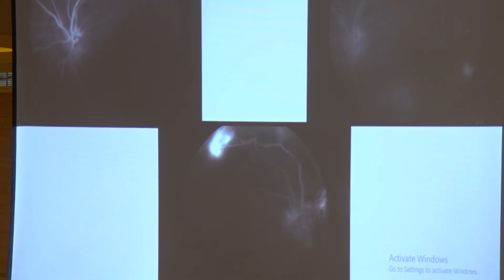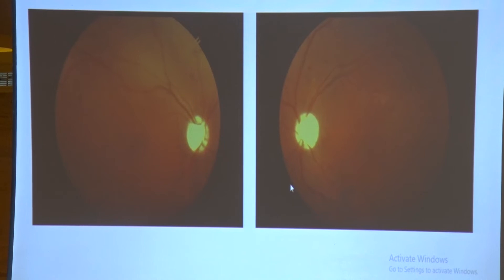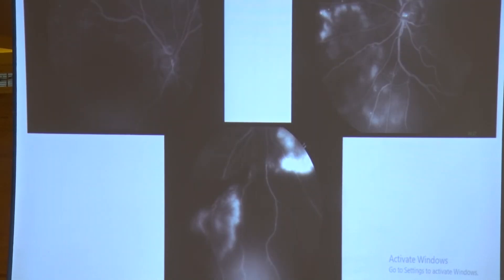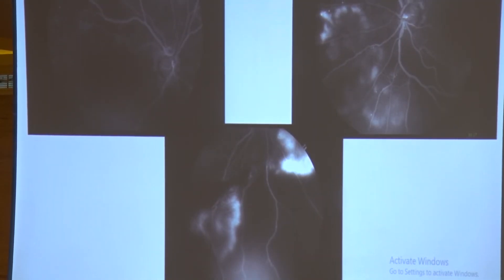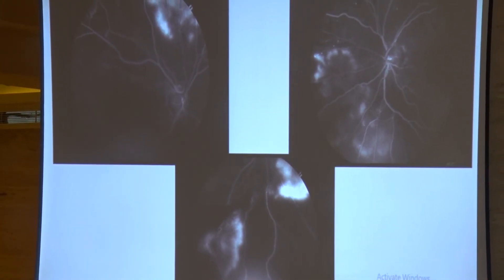You can get most of what you want to know. On the left eye, you can see the leakage in early phases and late phases. On the right eye, even in the presence of vitreous hemorrhage, you can actually see leakage from the superior temporal arcade along with proliferation at the disc. Another picture of diabetic retinopathy — these are images not from a Zeiss machine.